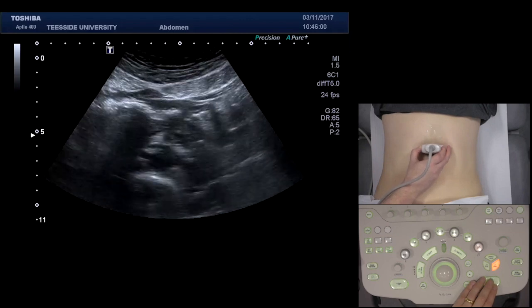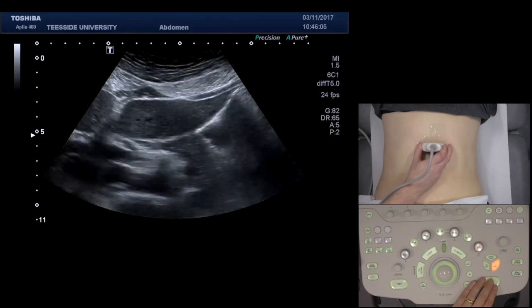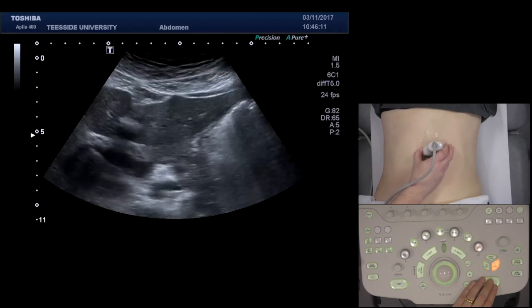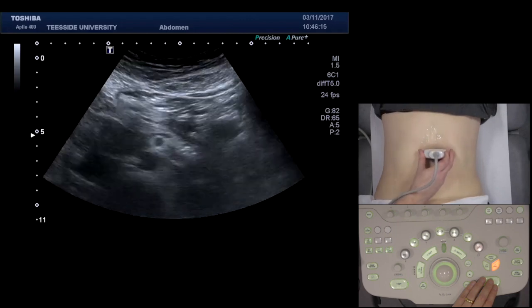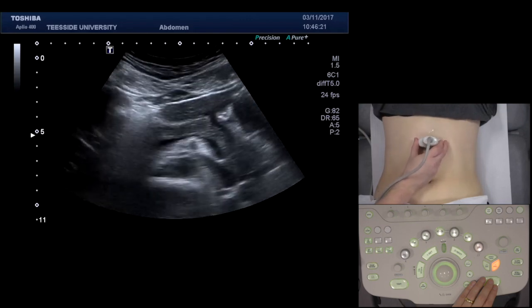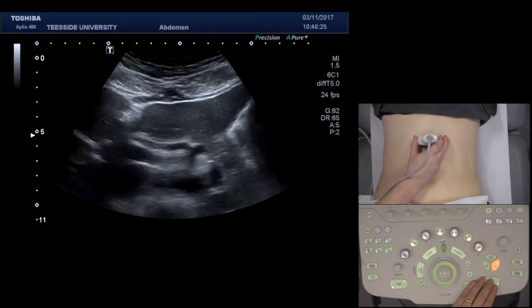We can also ask the patient to take different states of respiration. If you take a big deep breath and then breathe right the way out, that's actually made things worse. So we'll ask the patient to breathe completely out. Again, that hasn't particularly helped, but one of the other things we can do is ask the patient to push the stomach muscles out.